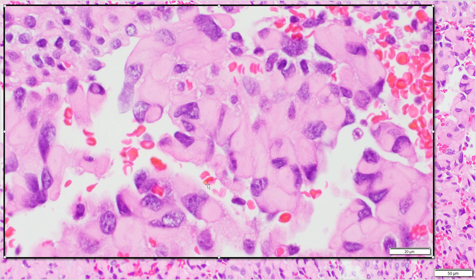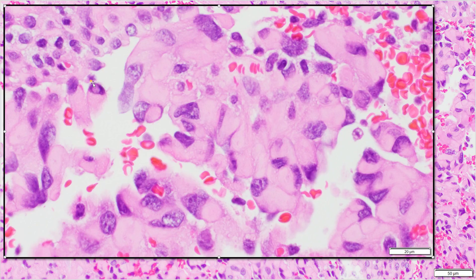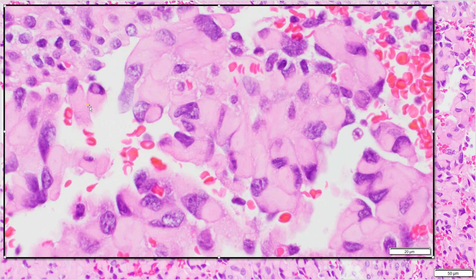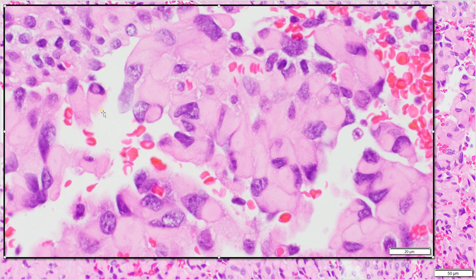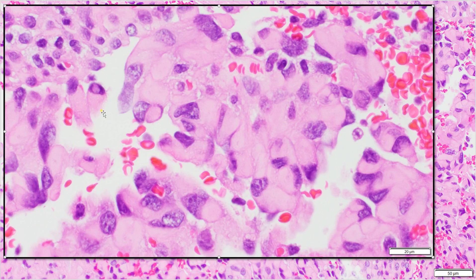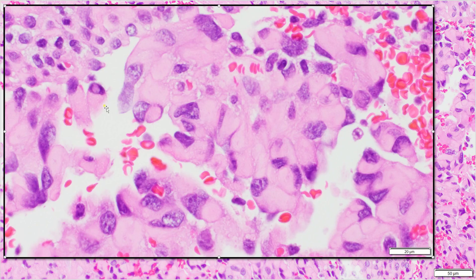We can see that the cells look kind of separated from each other — less syncytial than the other cells we saw. Syncytial means that the cytoplasm of one cell interdigitates very intimately with the cytoplasm of another cell, so under light microscopy we can't really tell where one cell ends and the other begins. But that's not the case for this area of the tumor.